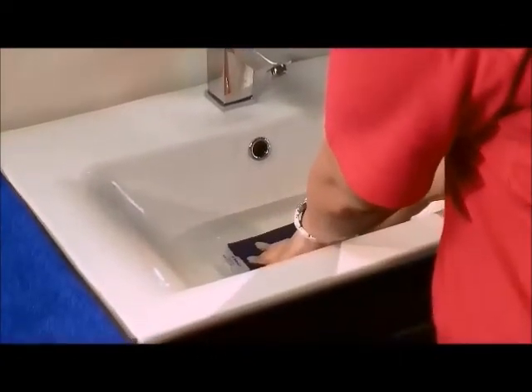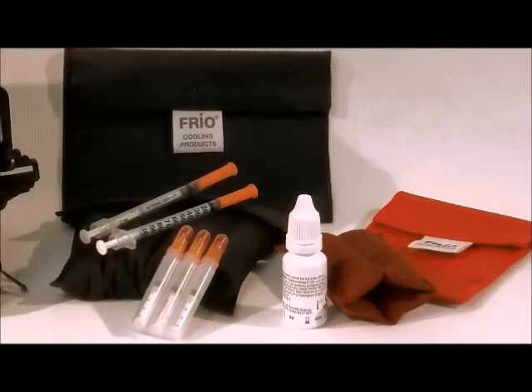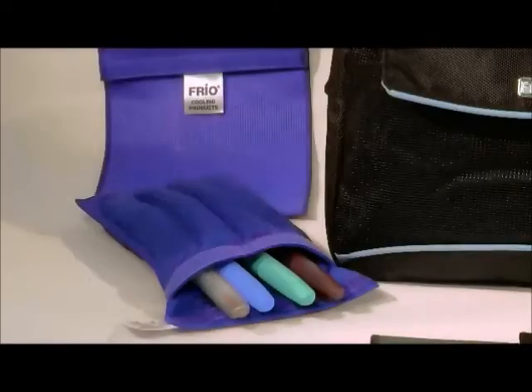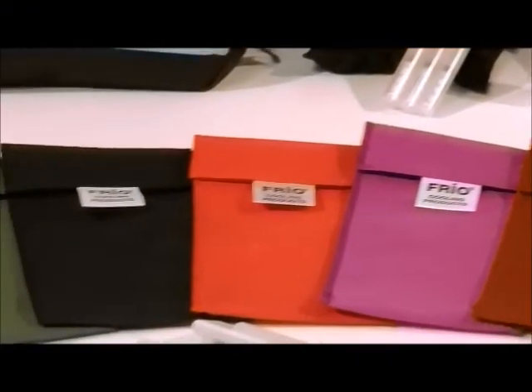The Frio Wallets are available in a range of sizes to accommodate medication in the forms of vials, syringes, pens, pumps, epi-pens, and many other delivery devices. They also come in a range of colours.